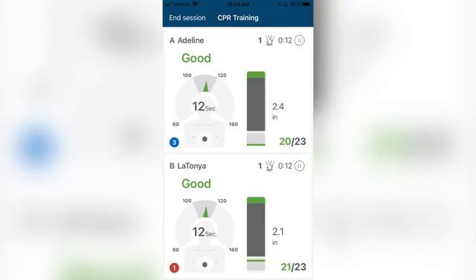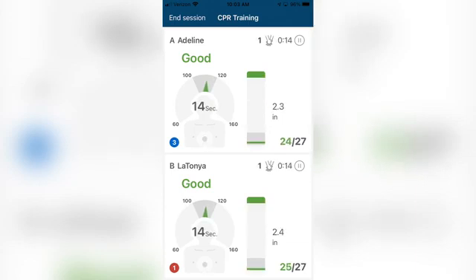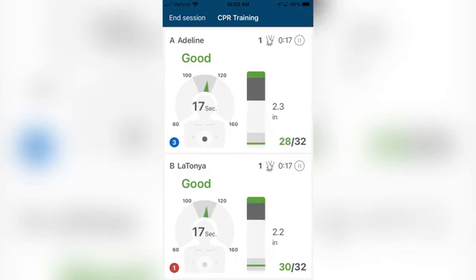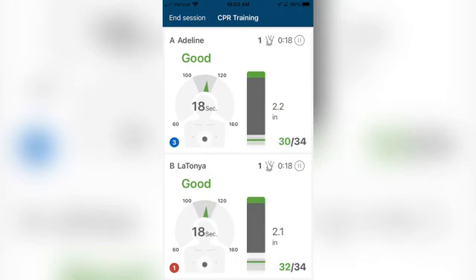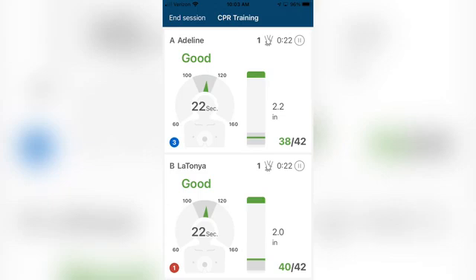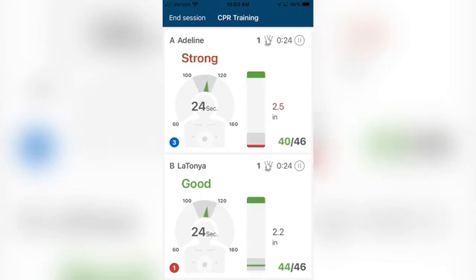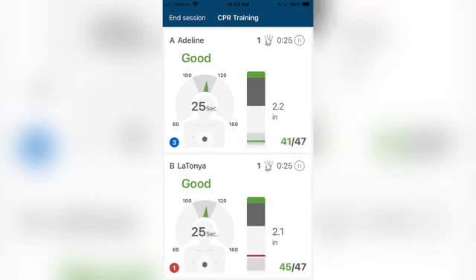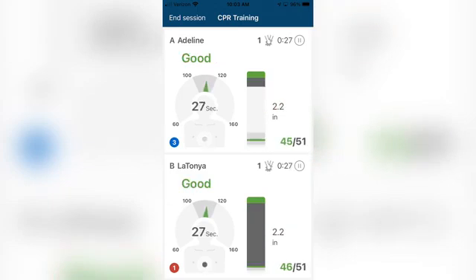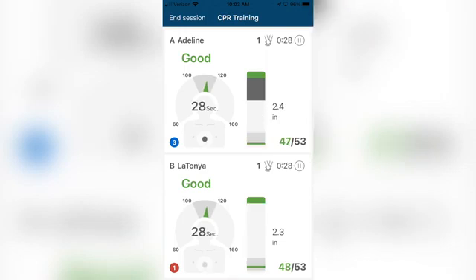Advanced CPR Feedback, which includes rate, depth, recoil, ventilation, and hands-off time, is monitored, easily displayed, and available for reporting, allowing students to self-monitor performance and gain confidence during CPR training.